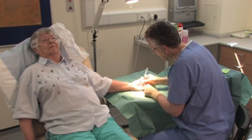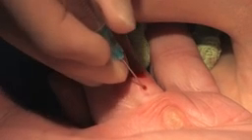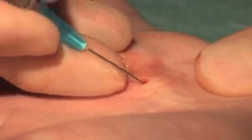The patient is asked to report any feelings of pins and needles or electric shocks during the procedure. After injection of the anaesthetic, the affected digit is held under constant tension and the fasciotomy performed. Cords are treated in a distal to proximal direction. In doing so, the nerve is less likely to become anaesthetised as different parts of the cord are released and so remains stimulable during the procedure, reducing the chance of inadvertent injury.